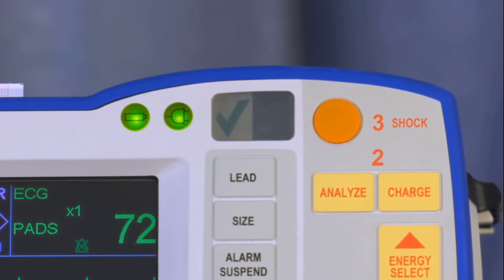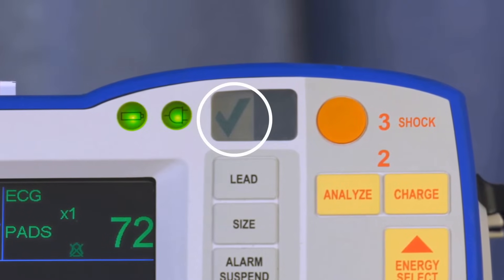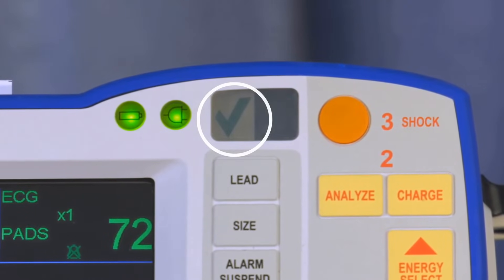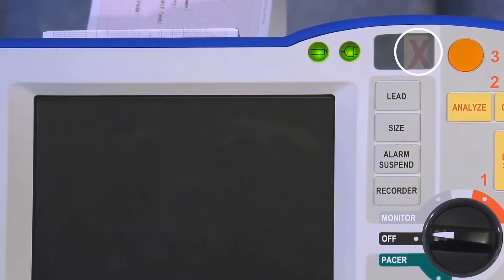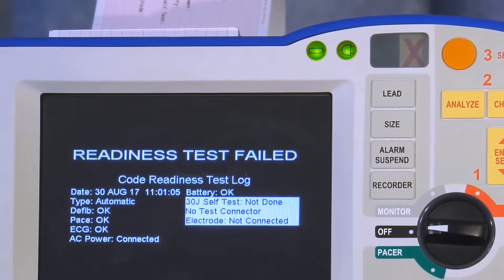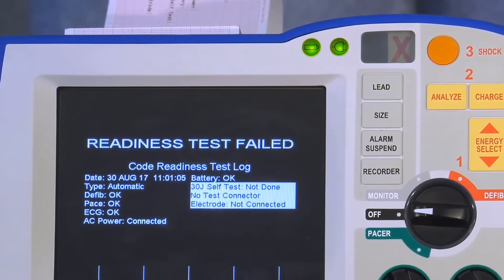After successful completion of the automatic test, the R-Series will have a green checkmark displayed in the Code Readiness Indicator window. If a red X is present in the window, the R-Series did not pass one of the automatic test requirements and a notification will be displayed on the screen.